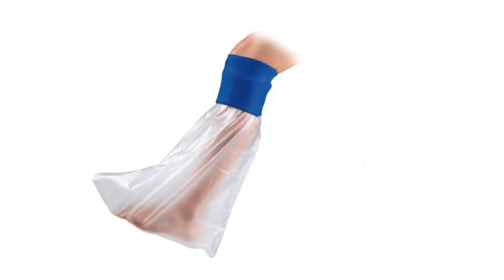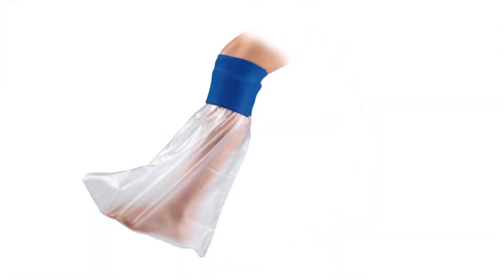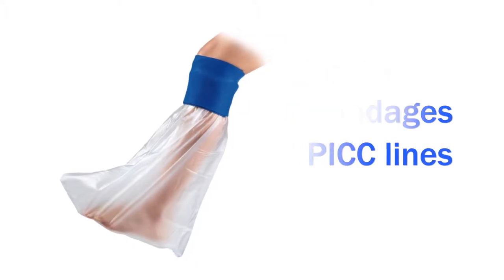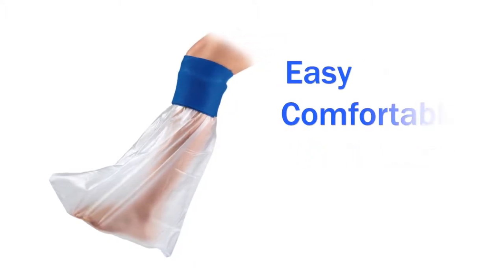Introducing the Shower Seal by MarMed. The Shower Seal protects casts, bandages, and PICC lines from water. It's easy to use, comfortable to wear, and durable enough for repeated use.